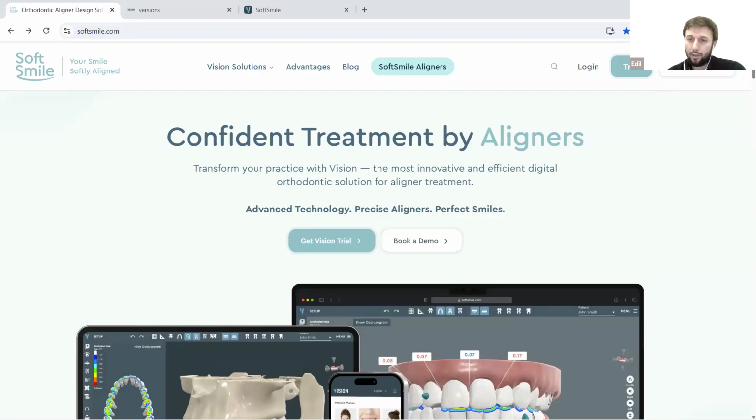The last question about IPR, we actually already updated it in the newest release. You can download the latest update. It's already available on the portal. And you should then be able to modify the IPRs as you were able to in previous versions of the software, even on the matching exercises. So that option has been restored.